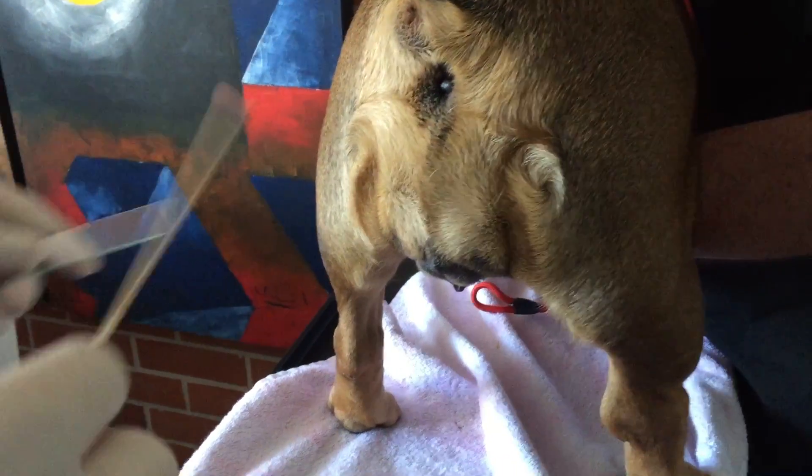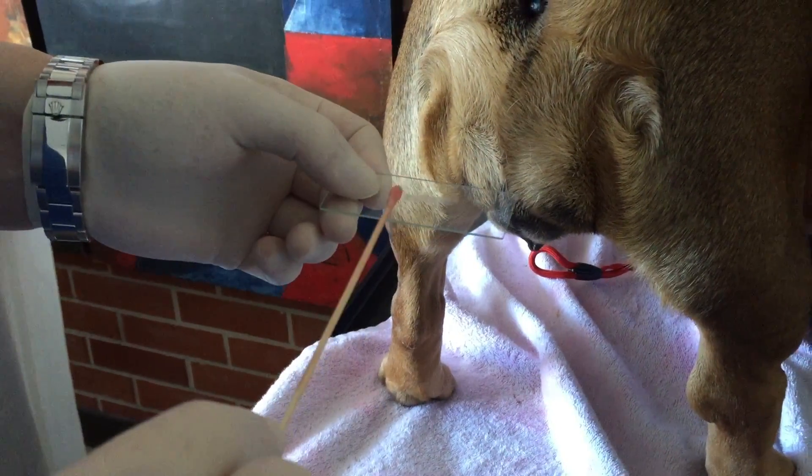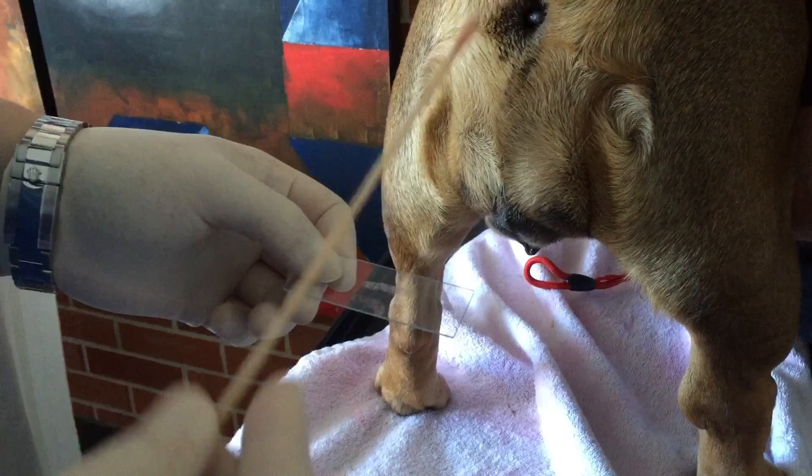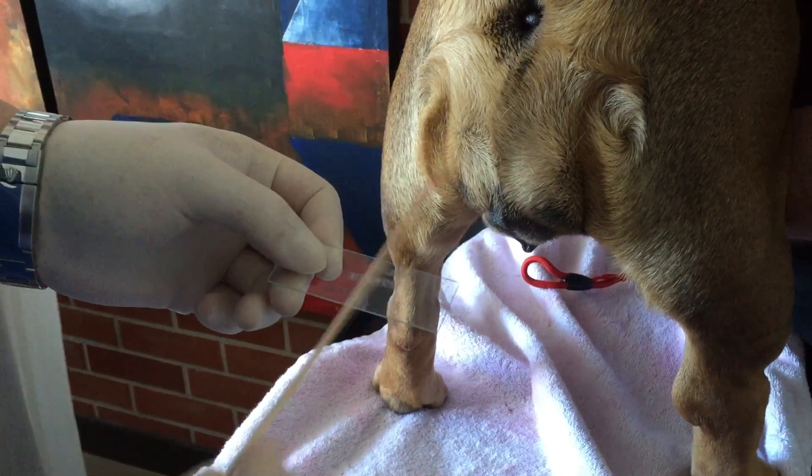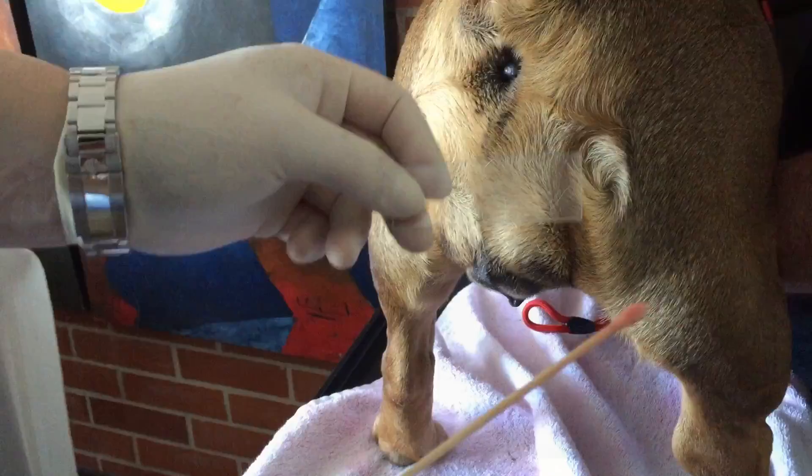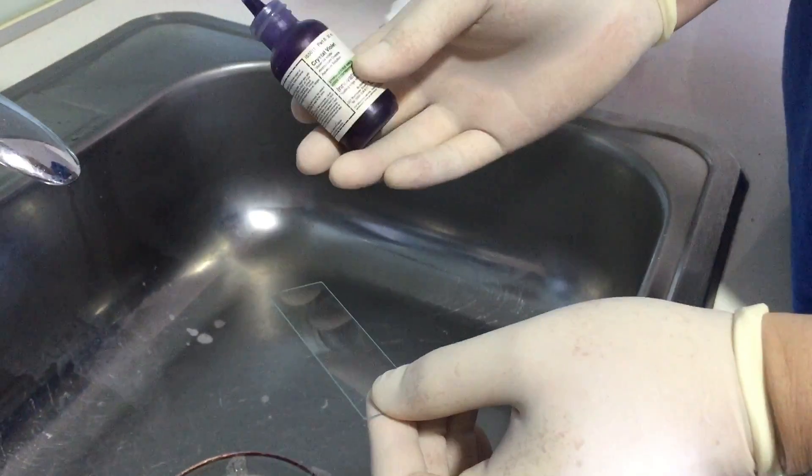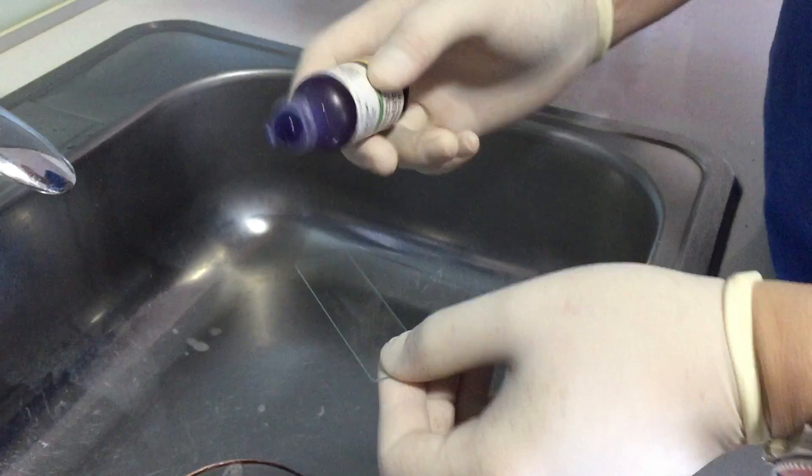We're gonna put this on the glass. Alright, let's go stain this. Okay, again I'm using gram stain. The method is, first thing you use is crystal violet.